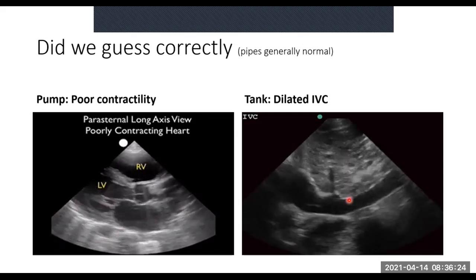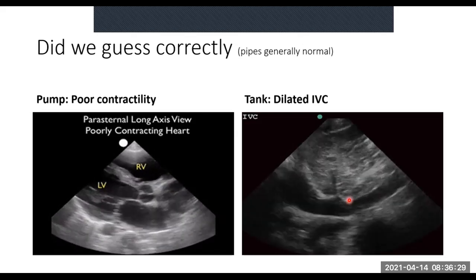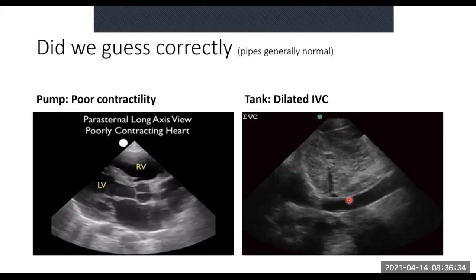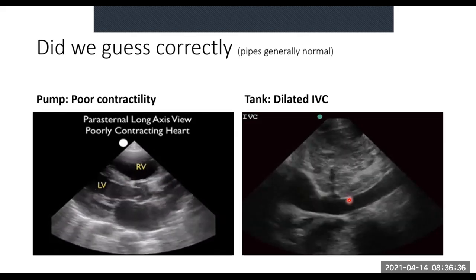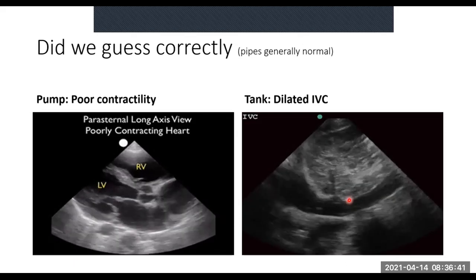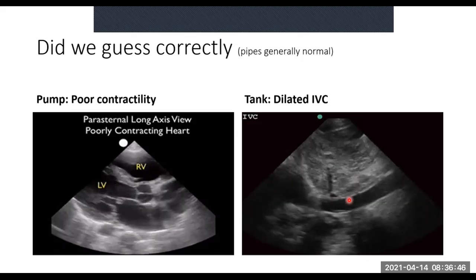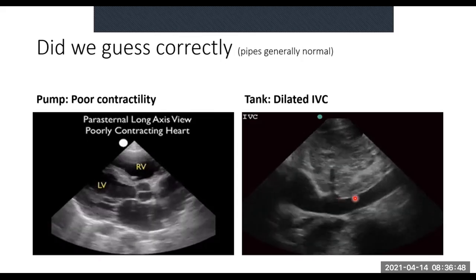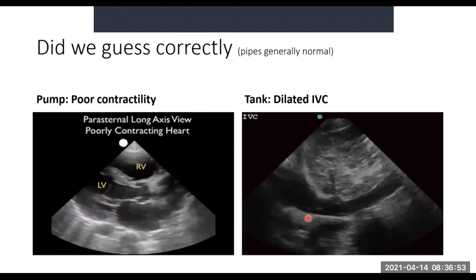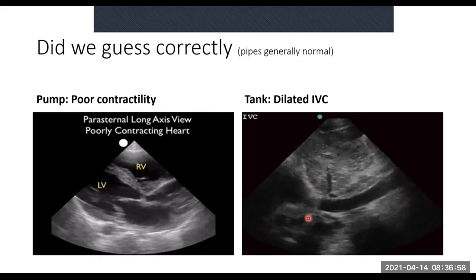If you have an ischemic patient who is fluid dependent, in other words, they're unable to pump out and they also have decreased levels of fluid, you can give them fluid. But what happens if you have a patient who's in CCF, has too much fluid already? It's no use giving them fluid, because all that fluid's going to leak into the lungs, causing pulmonary congestion. So compare this IVC to the one we saw the last time. It's barely moving. It's just sitting there because it's full of fluid. So you can't treat this patient with fluids.